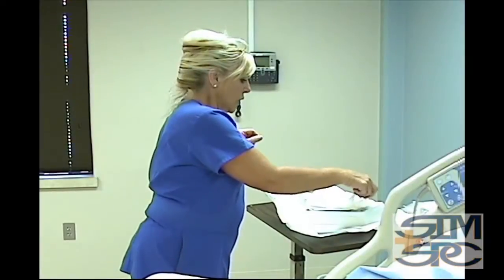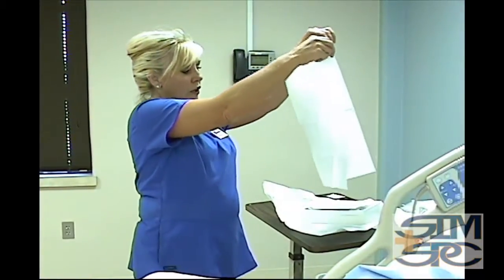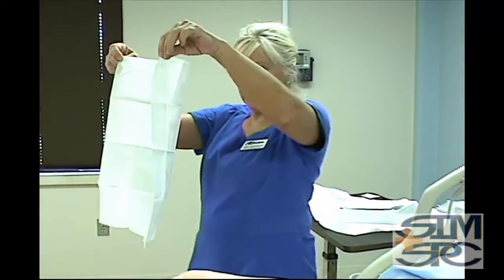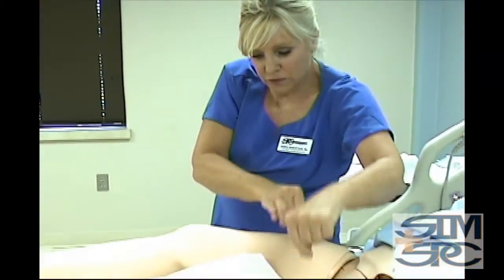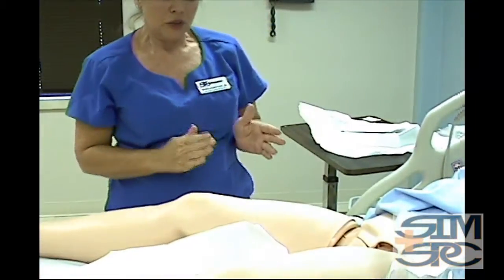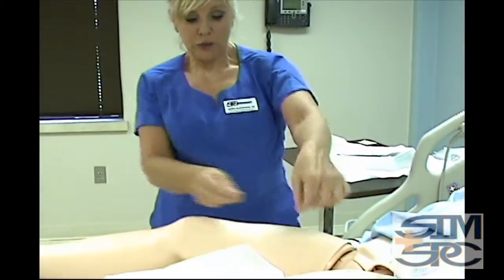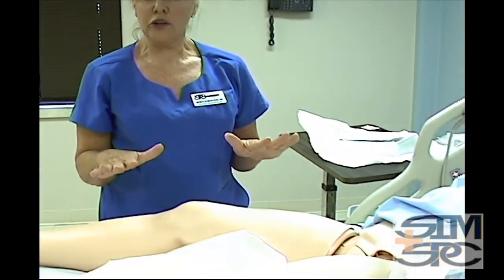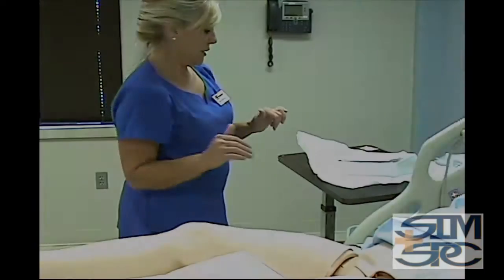Then you have your drape that you'll go between the patient's legs. It'll give you a little stiff feel. You're going to have the shiny side towards you. You're going to take the tips at each one and place it between the legs. If the patient can raise her hips, which this mannequin cannot spread any further, but if the patient can, then you can place it as close to the hip as you can. Leave it where it's at so you don't contaminate the field. And once it's down, it's down.